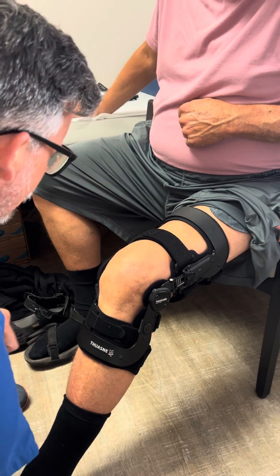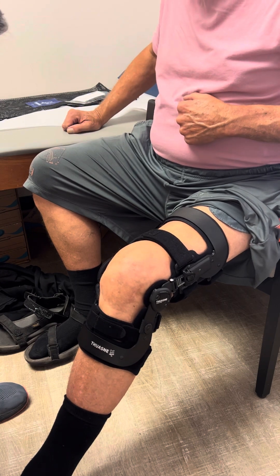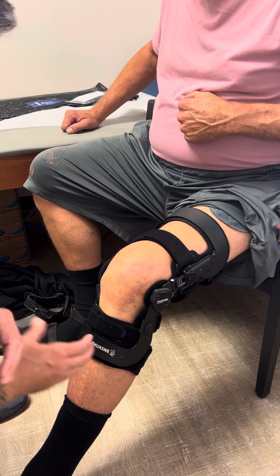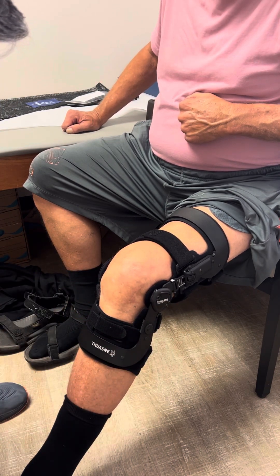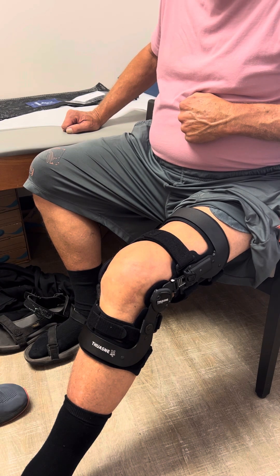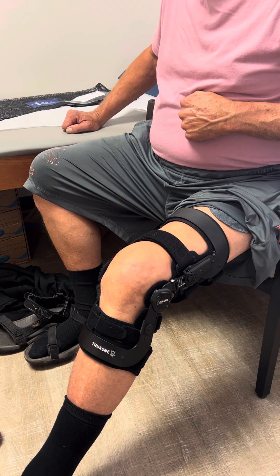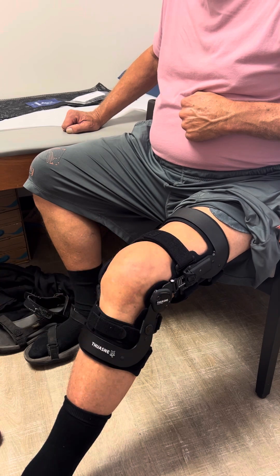At this point have the patient ambulate. On the first fitting, have them take a few laps in the clinic, then come back and check to see if it has drifted downward because it's not tight enough, or if any straps are loose, or if you need to make any adjustments. And that's it for this Townsend Rebel Reliever OA unloader brace — which is also a ligamentous brace. We didn't go over the unloading dial, but I just wanted to show the proper fitting of it.